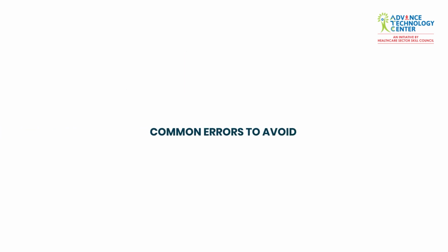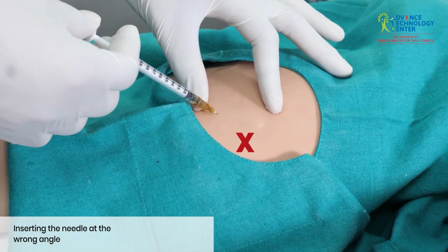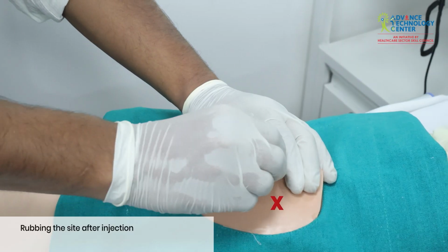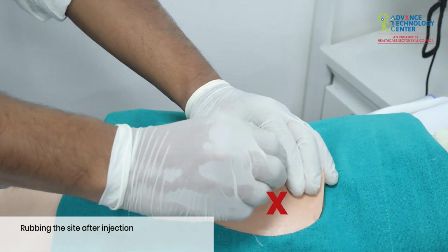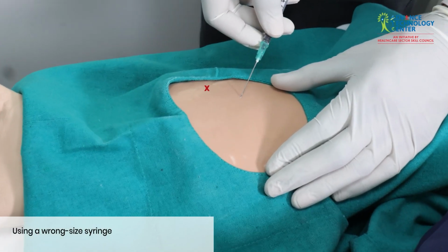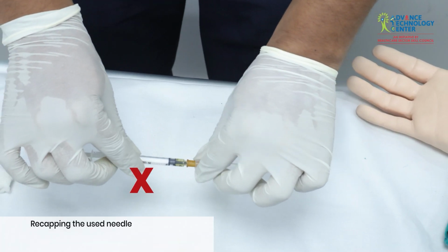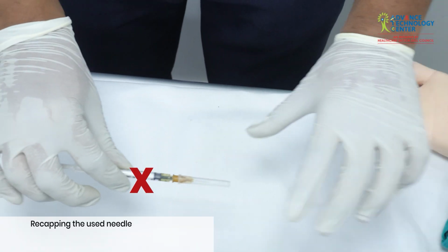Common errors to avoid. Be mindful of these common mistakes. Inserting the needle at an incorrect angle. Rubbing the injection site after administration. Using a syringe of inappropriate size. Recapping the needle after use, which poses a serious safety risk.